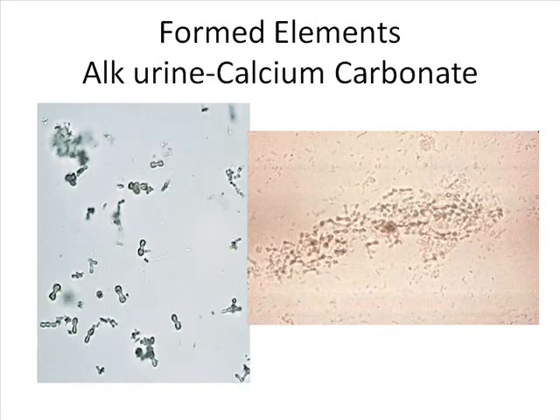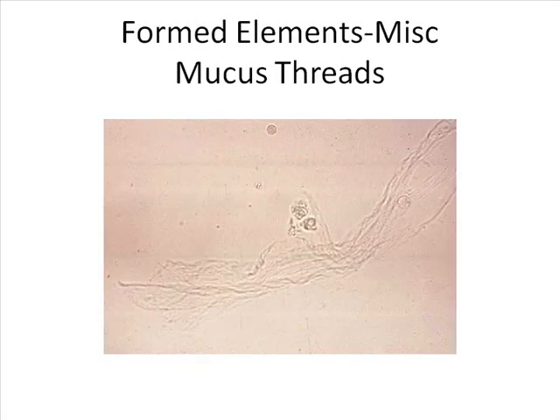Calcium carbonate, of course. Now, calcium carbonate, you can see this does look like, once again, that calcium oxalate that is from ethylene glycol, but you can see they're very closely related, and maybe in that particular patient you could also see some calcium carbonate. Totally normal. All right, mucus threads. Mucus can be secreted by totally normal people, maybe you have a little inflammatory process going on, maybe your urine is concentrated, and you will then have a lot more mucus.